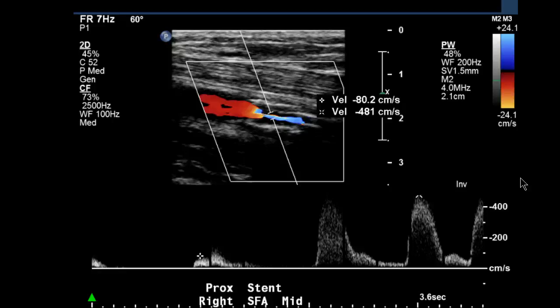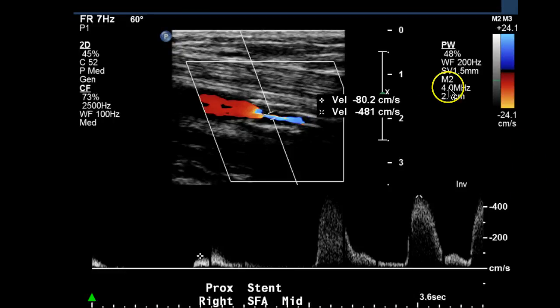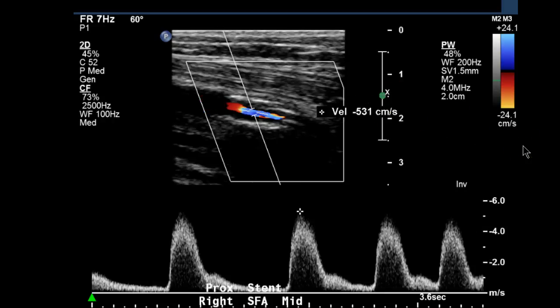The sonographer continues to take images and you can see the dramatic increase, where they've captured the spectral Doppler pre-stenosis and max site, where we have 80 to 481 cm per second. And another image shows 531 cm per second. So you can see that that's more than a quadrupling of the velocity in this segment.